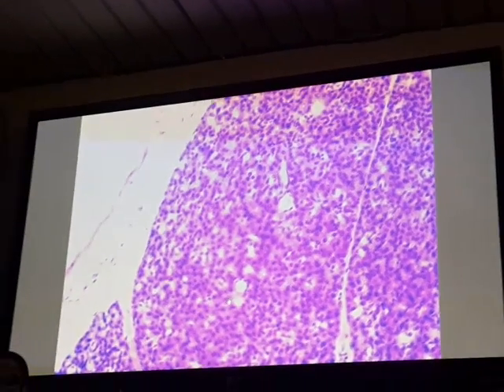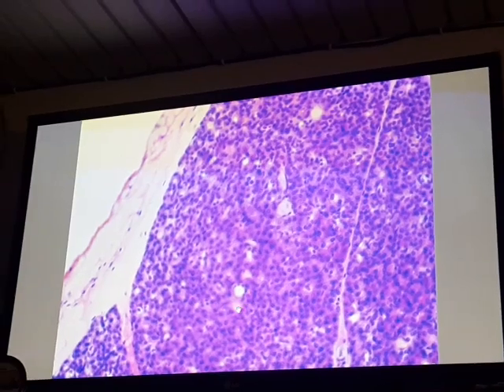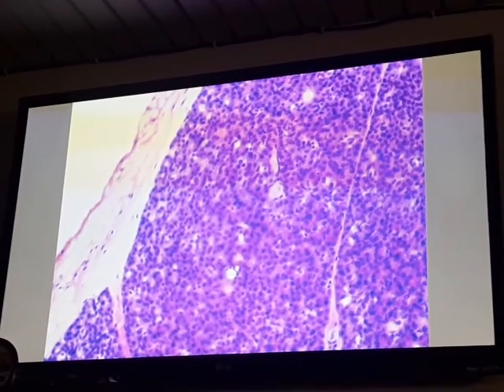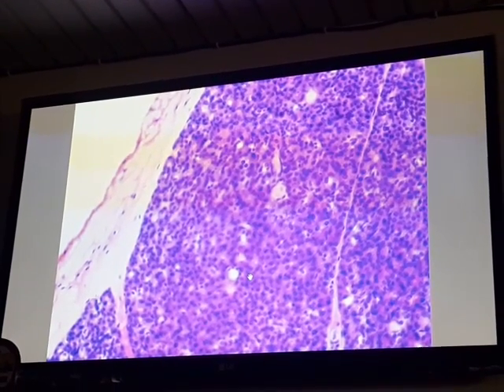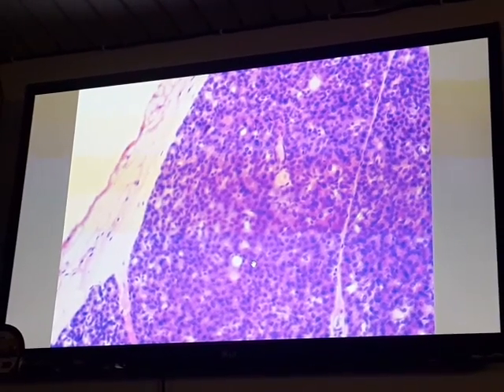The smallest duct found in the pancreas is the intercalated duct. The lining epithelium is simple cuboidal epithelium. These ducts empty into intralobular duct and then to the interlobular duct found within the septa of connective tissue.